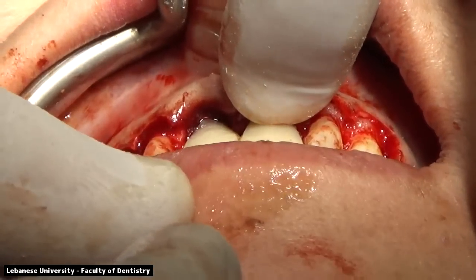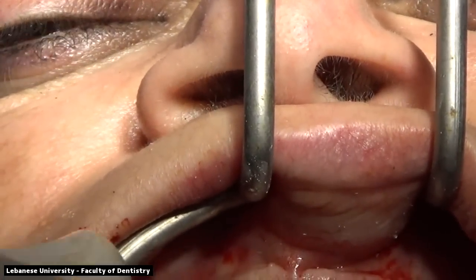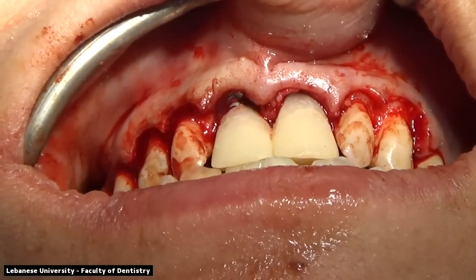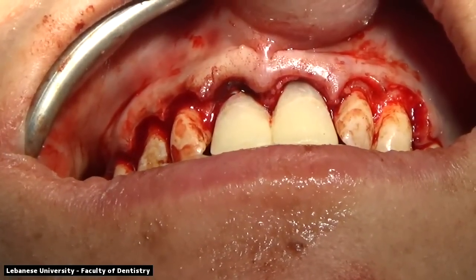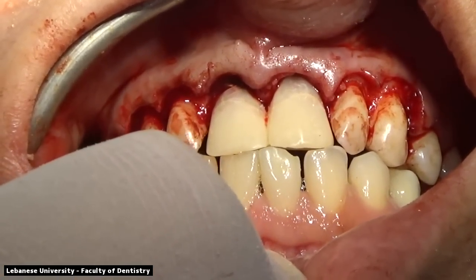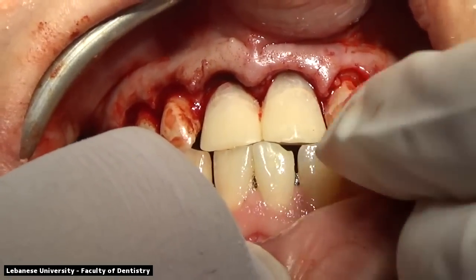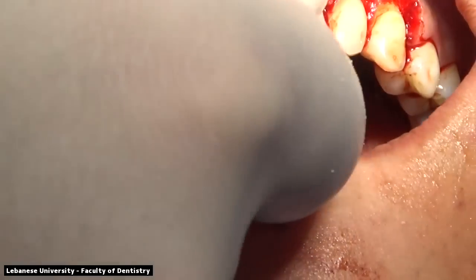Checking again the margins and the occlusion. You can see the emergence of the crowns with the neighboring teeth, the correct roundation and emergence. And we can see that we have an edge-to-edge bite with the lower anterior teeth. Because this patient, again, is in crossbite, so her occlusion is a crossbite occlusion, we are trying to change this relationship and turn it into an edge-to-edge kind of relationship.